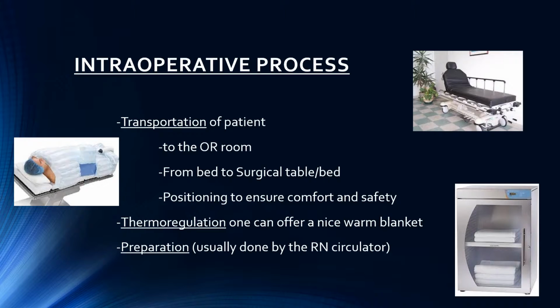The preparation is usually done by the RN circulator. What I like to do is, once in a while, while she's doing that, just glance over, make sure she's actually preparing the right eye, she's preparing it appropriately, just as a little safety check type situation. It doesn't have to get done. I just do it for safety reasons.